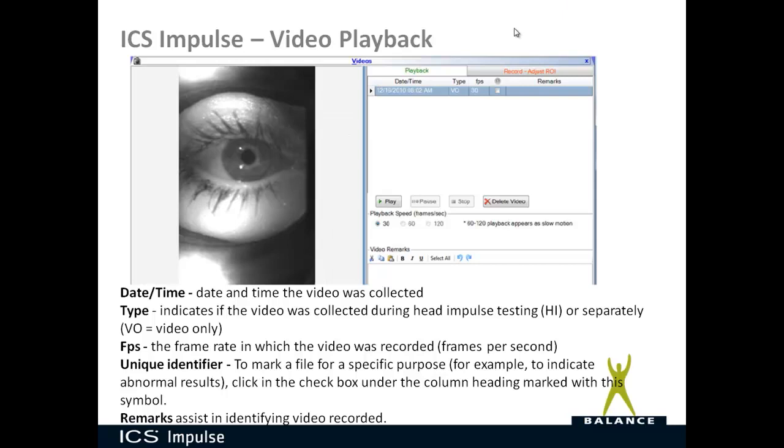Under remarks, this helps assist you in identifying video recorded. So if you did simple gaze or simple saccades, you could easily mark that in the remarks. Or if there's something abnormal about the video recording, then you could mark that in there as well to make it easy for you to remember what was of interest for that video.